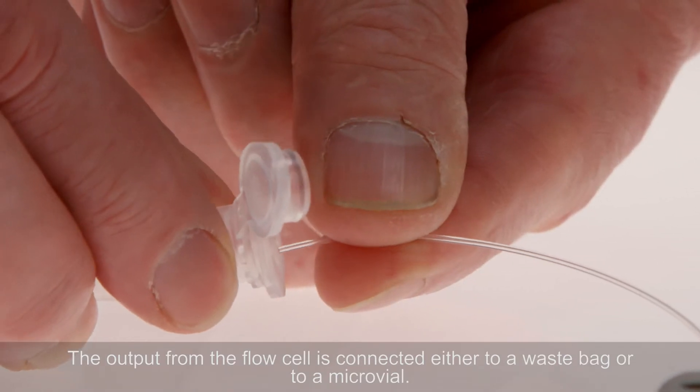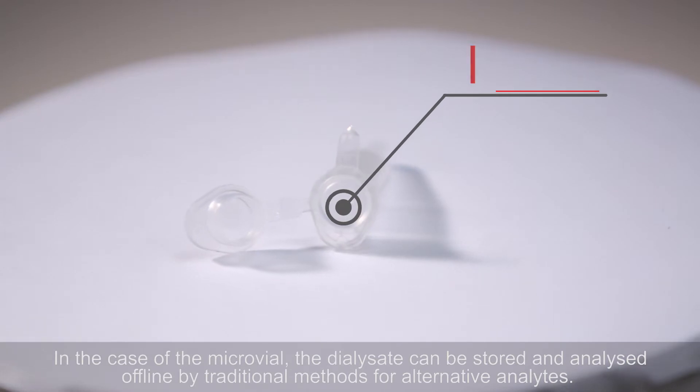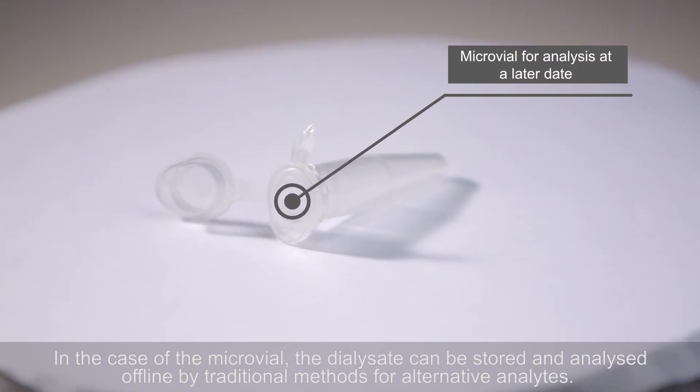The output from the flow cell is connected either to a waste bag or to a micro vial. In the case of the micro vial, the dialysate can be stored and analysed offline by traditional methods for alternative analytes.